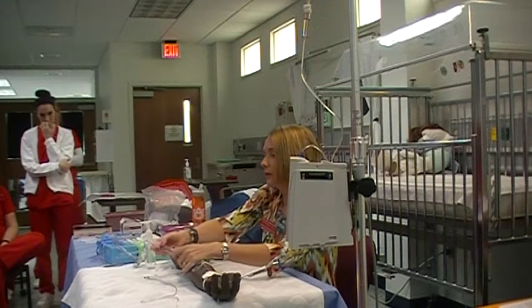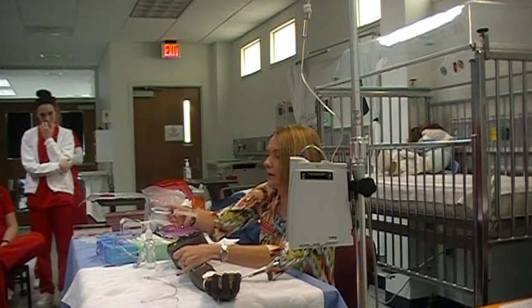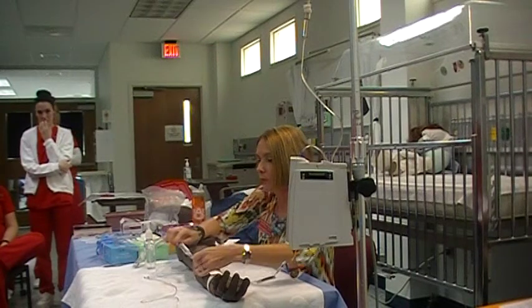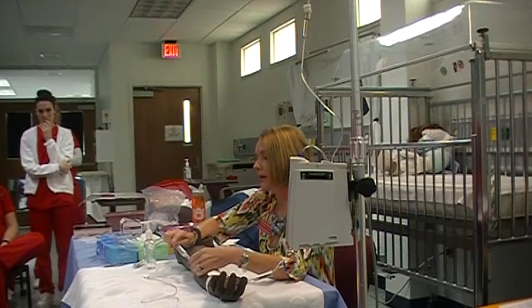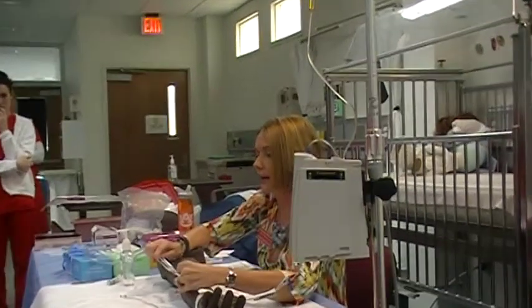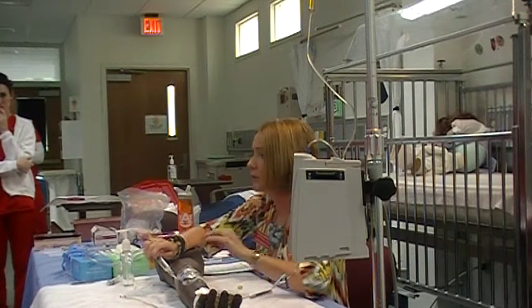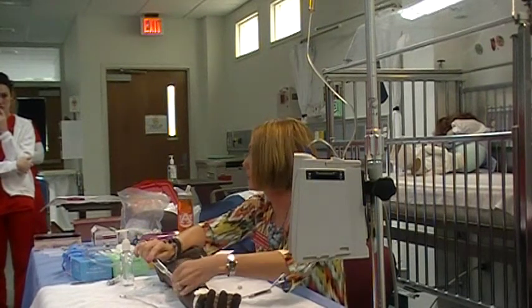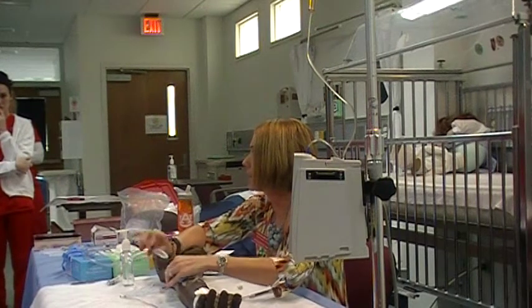And then one important thing I want to show you guys, and I know you should know this already, and you probably already do, but we have our saline flush and we're pushing, right? And this is just with our saline flush. We're pushing it, and as we're pushing it, we're going to clamp. Okay? Does that make sense? We don't disconnect and then clamp. While we're pushing that last 2 to 3 at the same rate, we're clamping. Okay? Any questions about that?